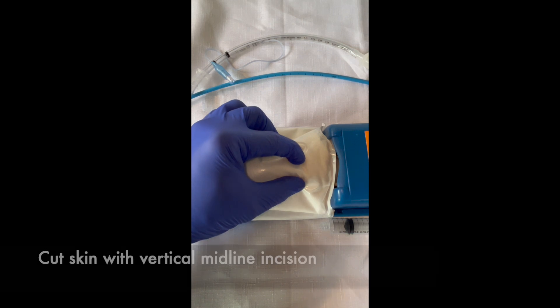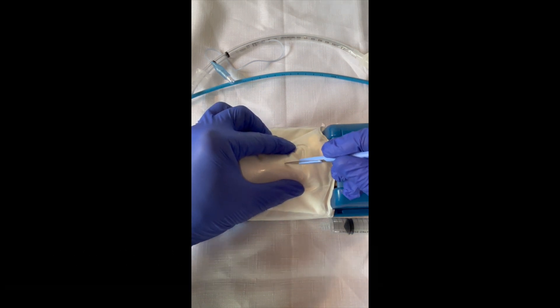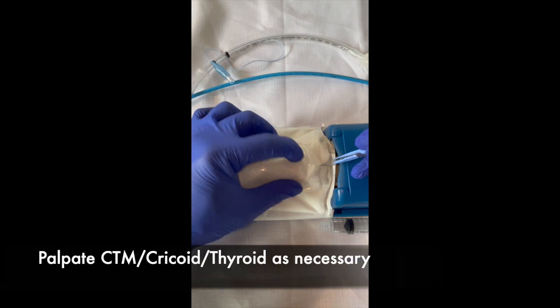We then make a vertical incision. If there's lots of subcutaneous tissue, we make a big incision. If it's obvious where the membrane is, we can make a smaller incision. But it's a vertical incision.